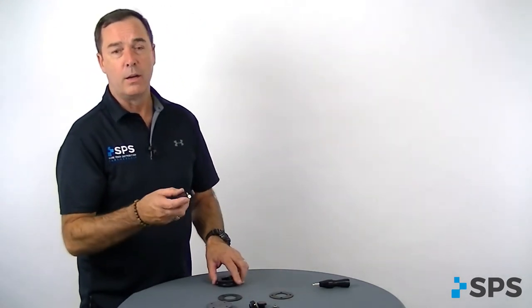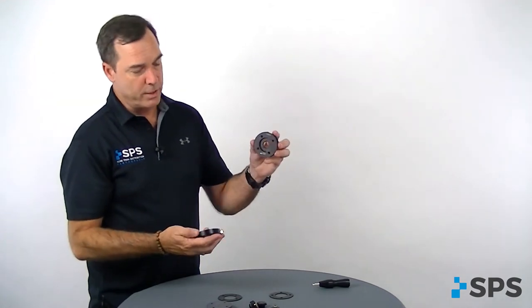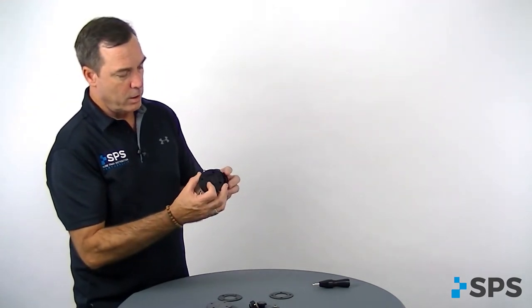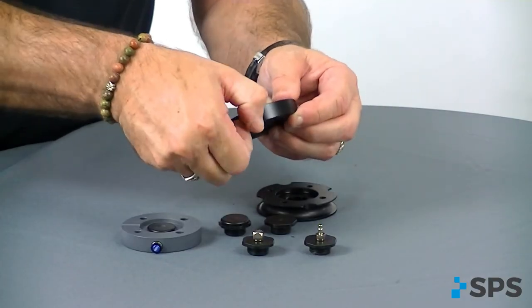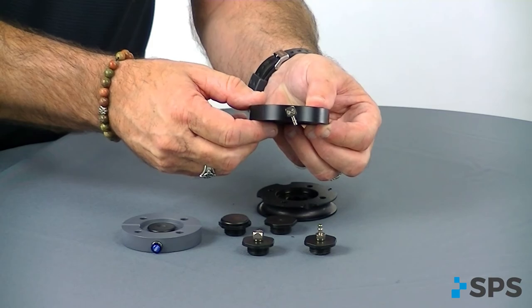And then we have our Aria HV plate, which configures with the Aria tie-in plate. You've got push-button release with a 90-degree barb going to your exoskeletal or elevated vacuum systems with a tube.